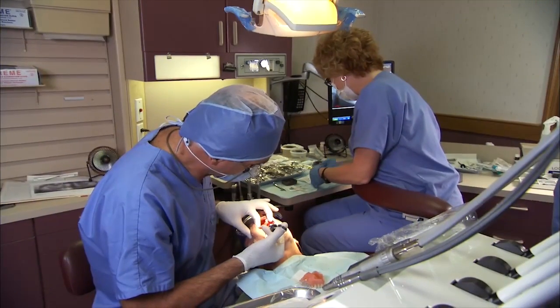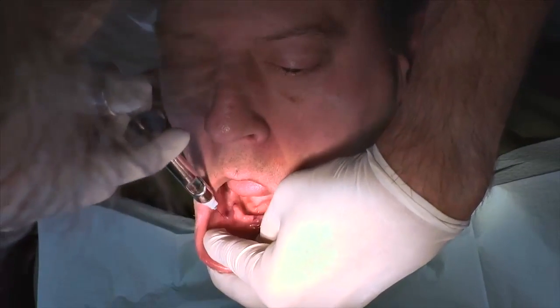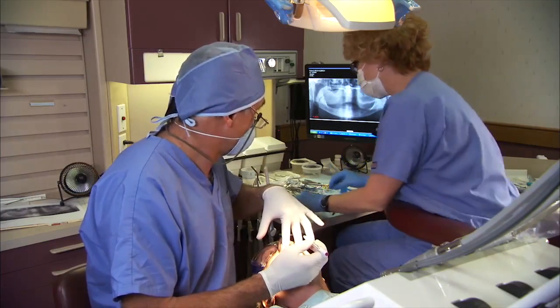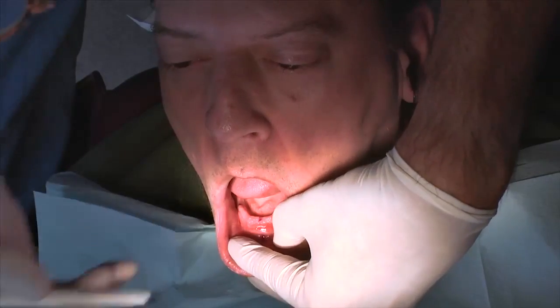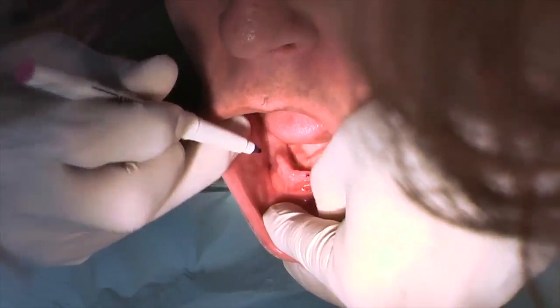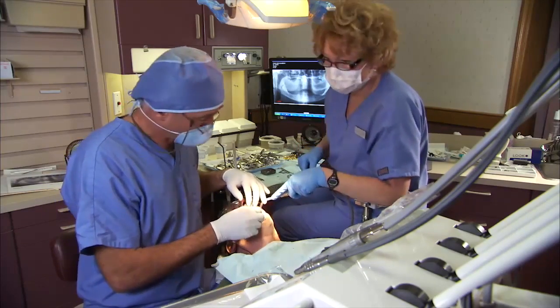Prep the patient following standard dental surgery guidelines and administer anesthetics sufficient to numb the mandible and surrounding tissue. Gain clear access to the lower gum ridge where the implants will enter the mandible. Mark the proposed site for each implant. Use sterile irrigation throughout the procedure.